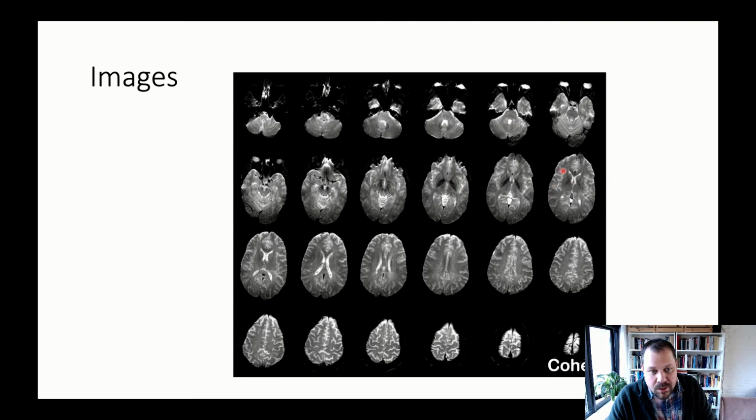The ventricles here are shown in white. So these are the ventricles here and back here. And the further up you go, the more you can see of the cerebral cortex areas here. So finally, you end up with the top slice here. And this is then summarized into one 3D volume that we have and that we work with. And that's how we make 3D images, basically.